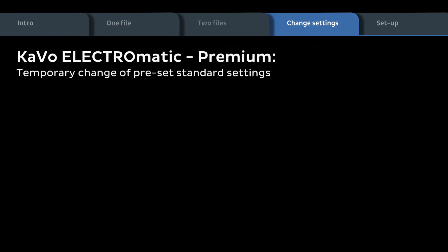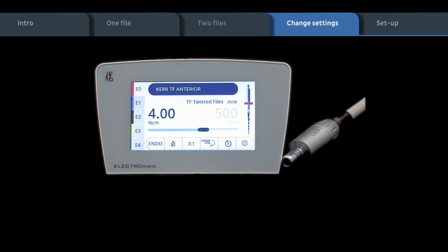Temporary changes of preset standard settings. Temporary changes have to be done in the endo working mode. When switching to another file, the temporary change is removed.